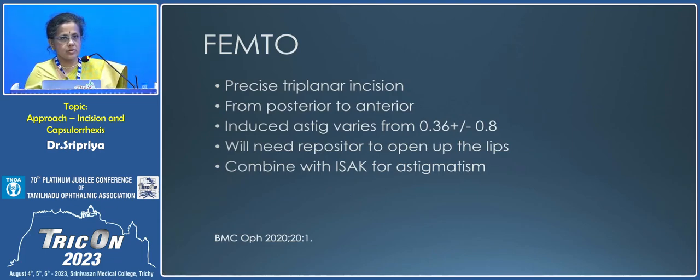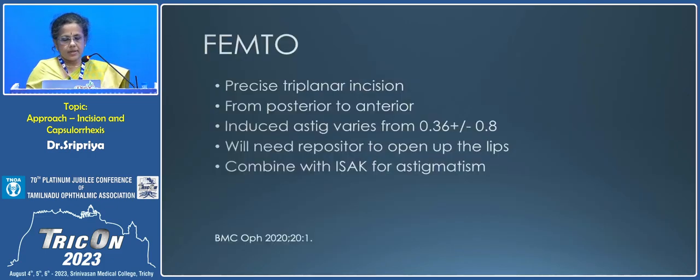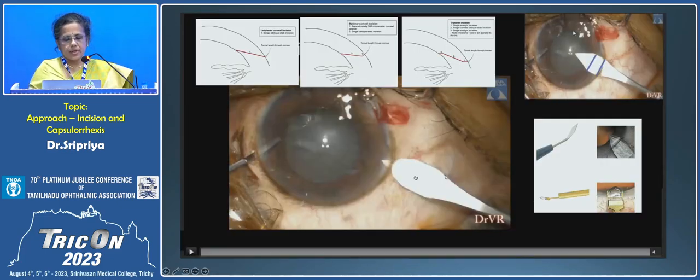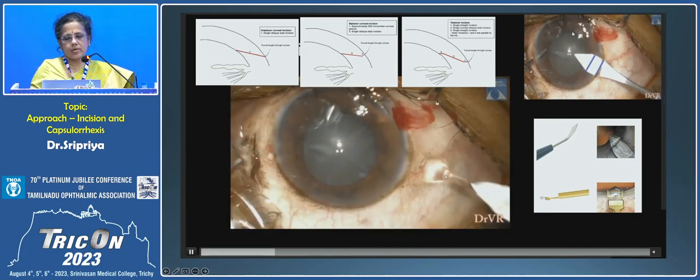Femto laser can also do main incisions, and it is from posterior to anterior, extremely precise, but you still have some tags which may have to be opened up using the repositor or the keratome. And if you compare the astigmatism created by the femto laser against an experienced surgeon, the femto laser loses, hands down. And if you come to the wound construction, it can be uniplanar, biplanar, or triplanar.